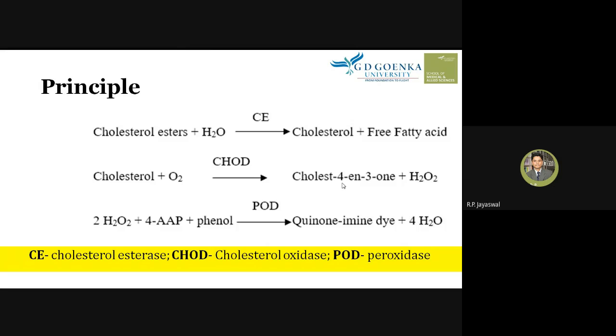This test is totally dependent on enzymatic reactions, and this is one of the very specific tests. Why do we consider this test a specific test? Because here the enzymatic reactions take place. The enzyme only recognizes its own substrate. So the enzyme cholesterol esterase only binds cholesterol esters. Cholesterol oxidase only binds cholesterol. POD only binds hydrogen peroxide. So this is the enzyme and their respective substrate.